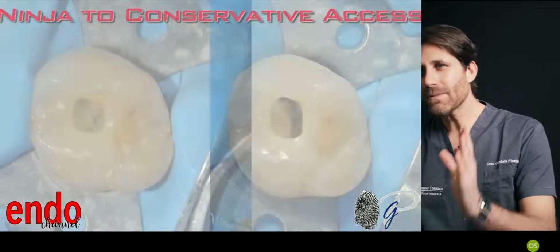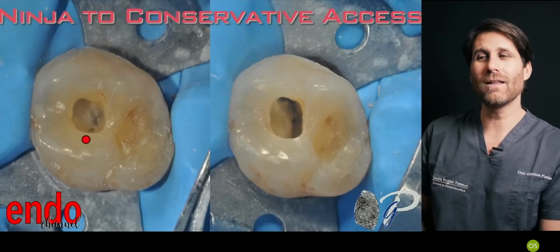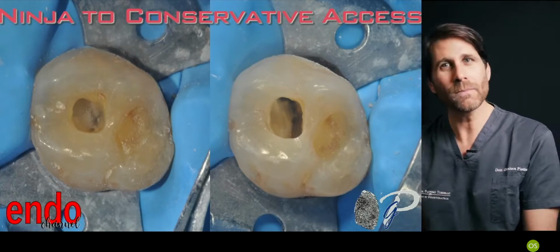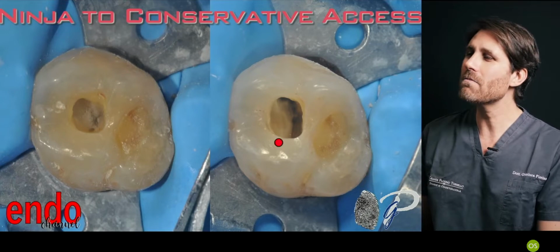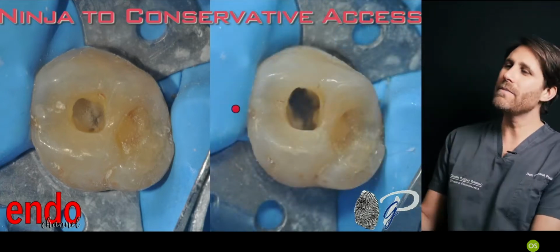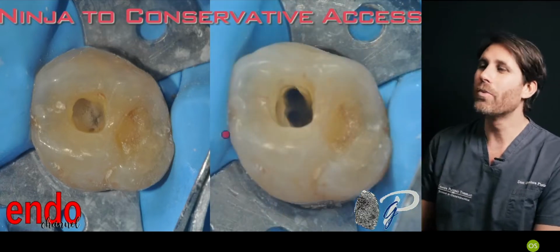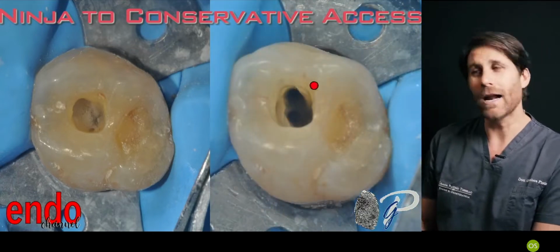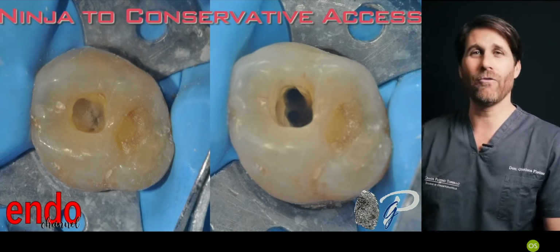So let's move from Ninja to conservative. It is not needed to maintain a Ninja access. We can start from it, we can study the anatomy, and then we can enlarge a little bit more into an access cavity like this one that permits us to visualize all the root canal orifices, to prepare all the root canal anatomy. We need not to miss any root canal, of course.